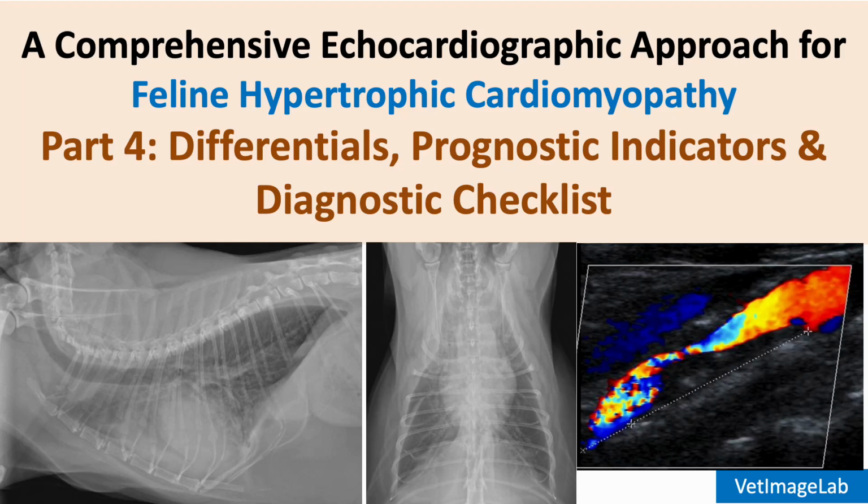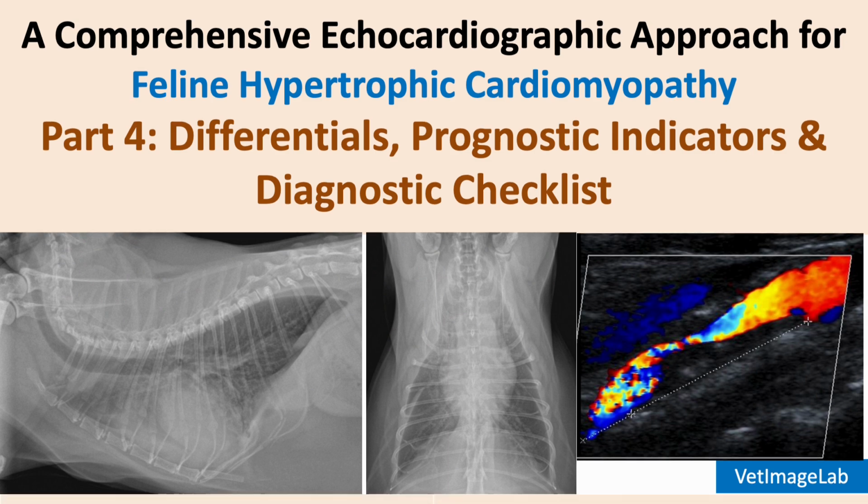This is part 4 of our echocardiographic series on feline HCM. In this final lecture, we'll cover: 1. Important differential diagnoses, 2. Key prognostic indicators, 3. And a practical checklist for diagnosing HCM with confidence.